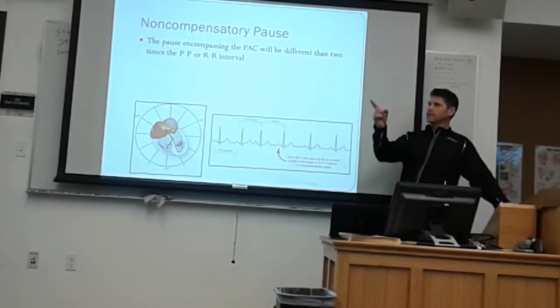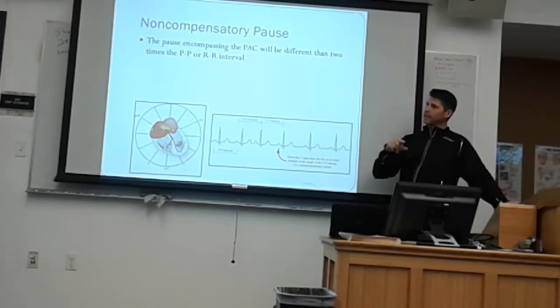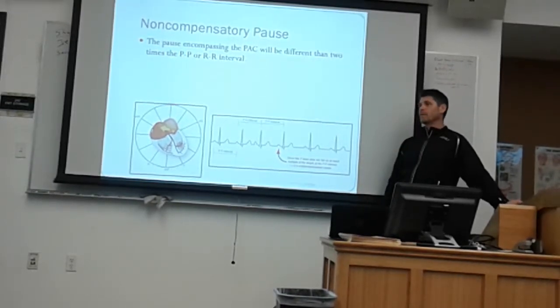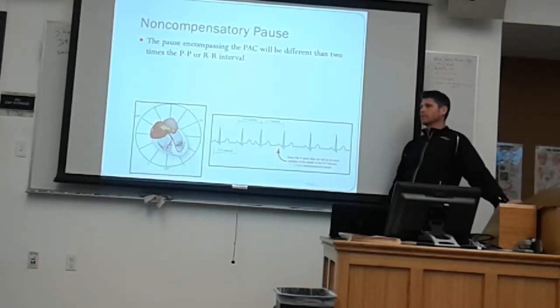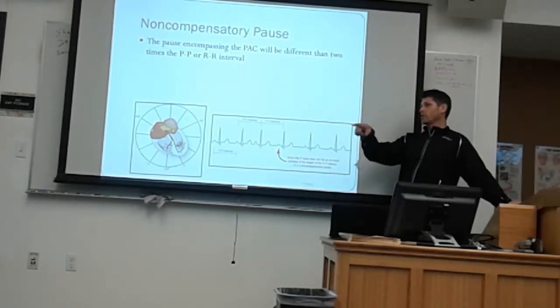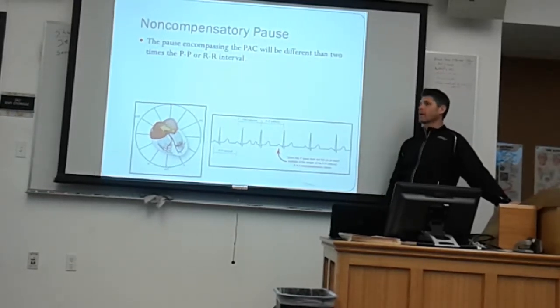And if, as Annalise and I just discussed, they happen frequently and they're non-perfusing when they happen because of the timing of when they happen, then that becomes a concern. So when we're documenting this, we have to say whether it's not compensating or compensating? So I want you to start paying attention to whether they're compensated or not compensated, yes.